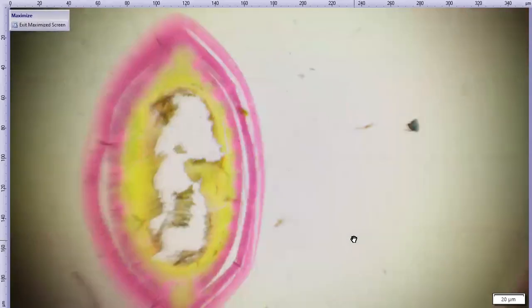So this is a tiger. Well, let's go down here. I'm using it as a sort of generic, kind of generic mammalian eye. The reason why this histosection of the tiger eye is yellow is because it was fixed in Bouin's solution. So this is remnant picric acid that didn't wash out of the tissue, not because it's got a yellow lens.